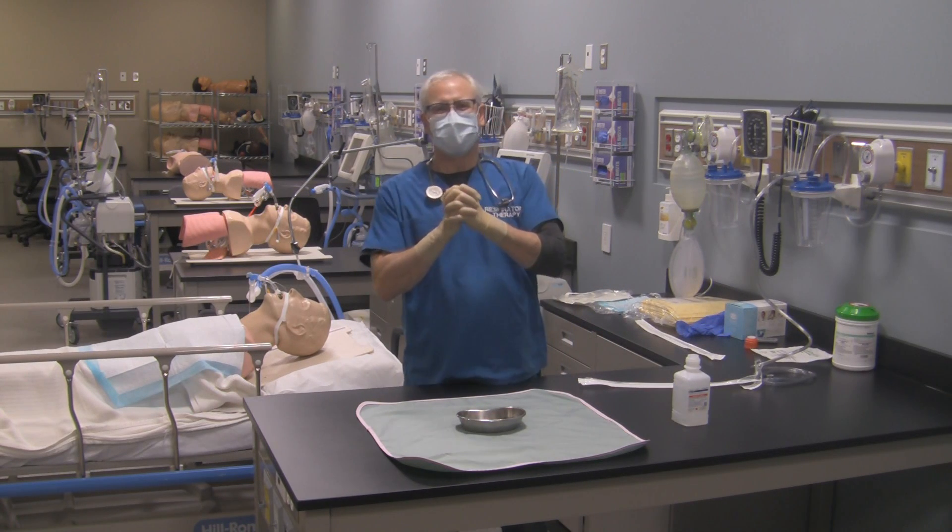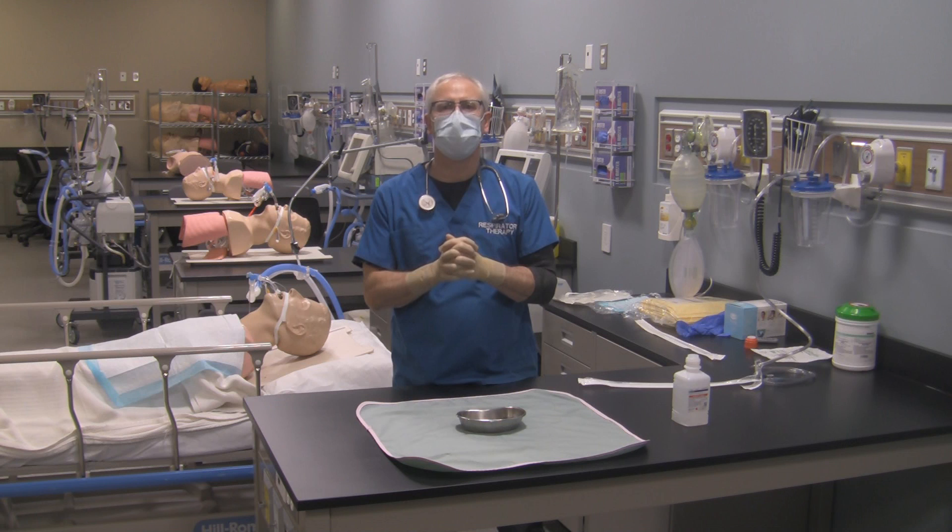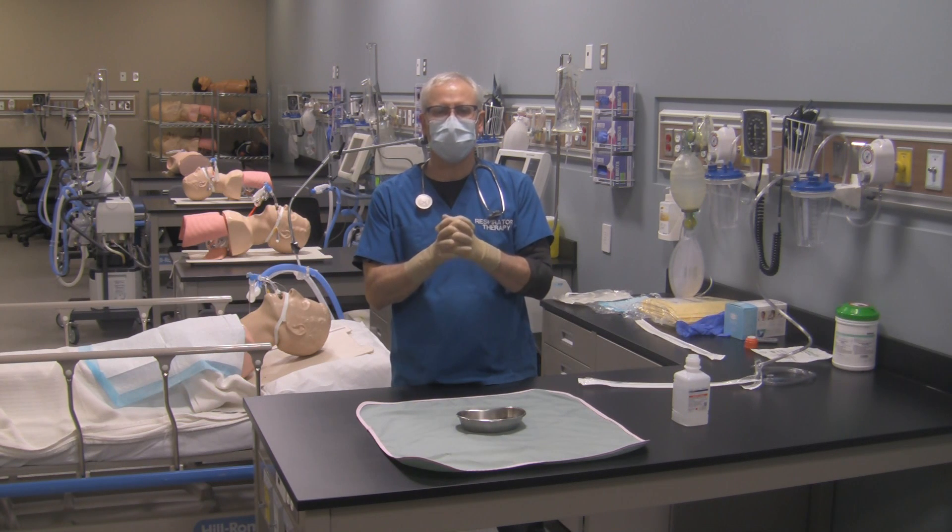George here. Hi again. What we're going to do in this video is I'm going to show you how to perform open suctioning on your patient with the artificial airway with sterile technique.